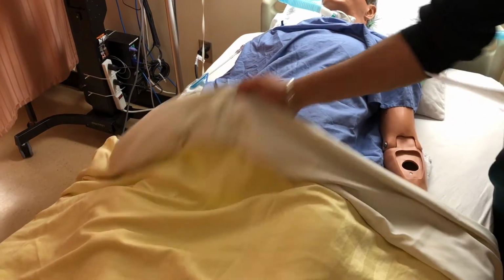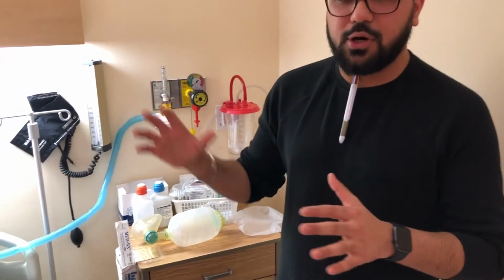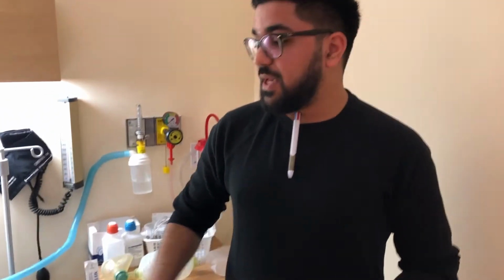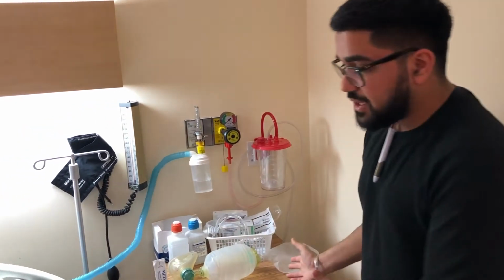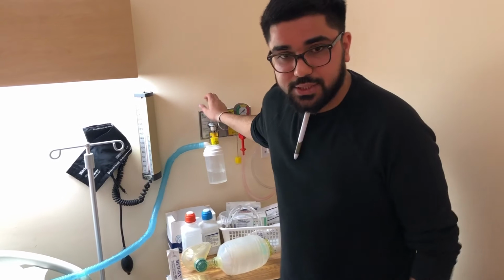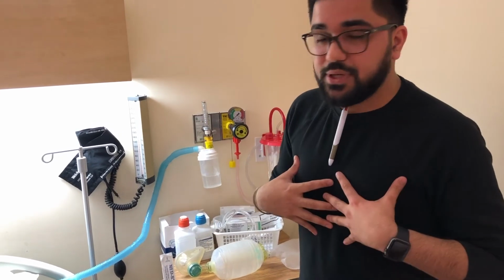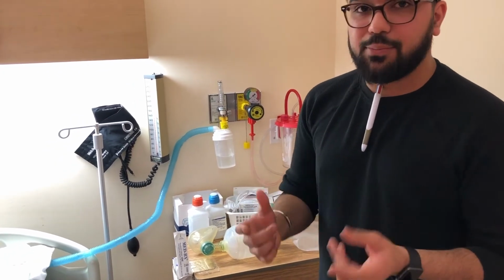That's good. You could state the name. We know this is the correct patient. So what we want to start off by is doing something called pre-oxygenation, which is where we oxygenate the patient right away. In our IPN, it did state that the patient is able to take breaths on their own, so we don't need to ambibag the patient. What we could do is increase the oxygen to 15 liters and get the patient to take two to three deep breaths, and that will hyperoxygenate the patient.